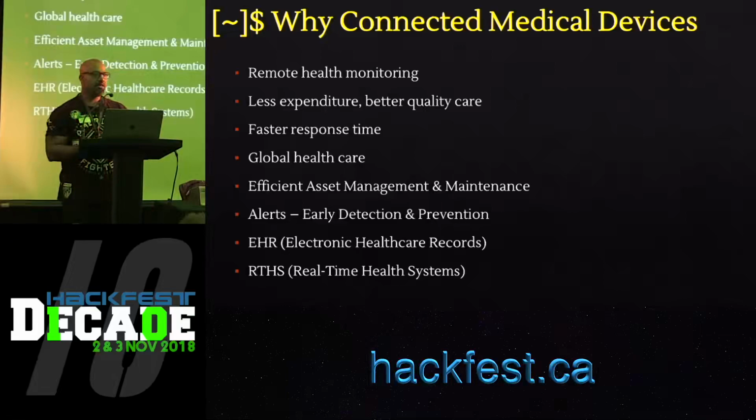It came with fully updated Windows Defender. There was a docking station, and the docking station had most of the functionality. The docking station is the one that had the USB port and VGA ports and all that. Then there was a software layer, which basically comprised two applications that came from the manufacturer. Since it had USB, HDMI, and VGA, we could connect a keyboard, a mouse, and a monitor to it.